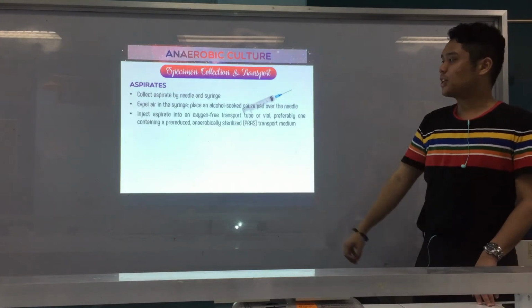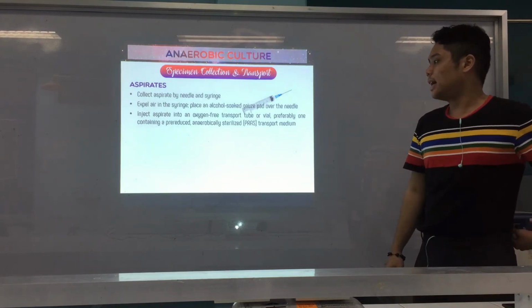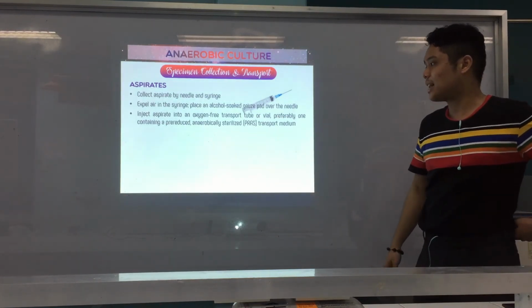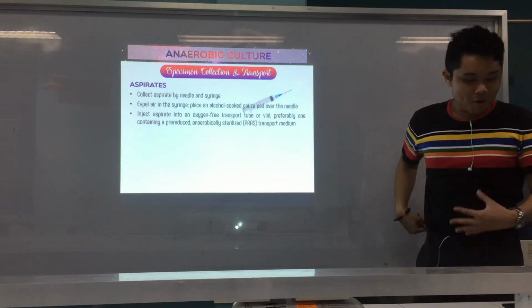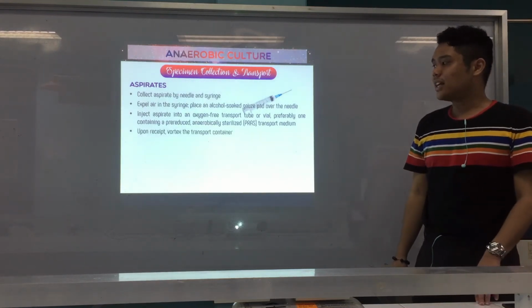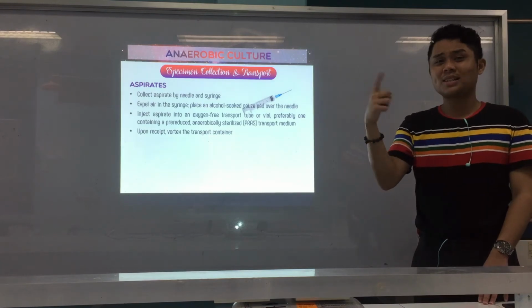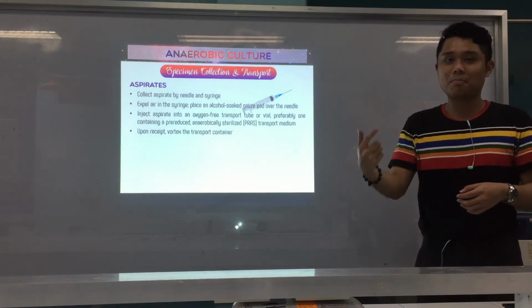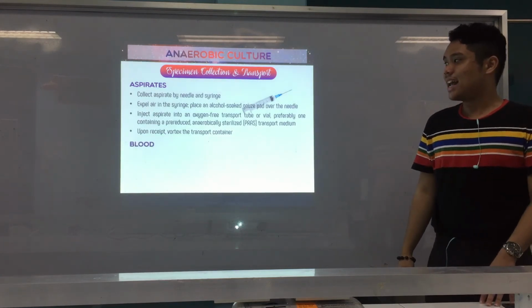Okay, inject aspirate into an oxygen-free transport, again preferably containing a pre-reduced anaerobically sterilized transport medium. We'll know about that later. And upon receipt, vortex. When you say vortex, imo siyang i-homogenize or imo siyang i-concentrate? Okay, vortex, imo siyang i-spin. Alright, okay. And yeah, that's for aspirates.